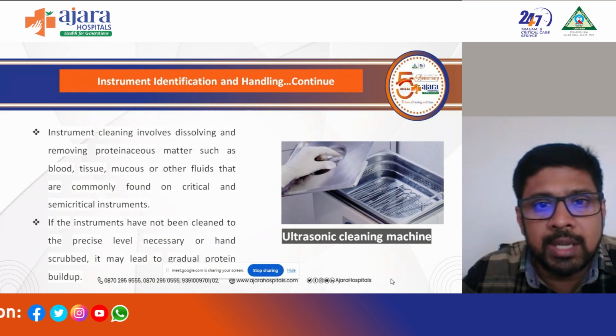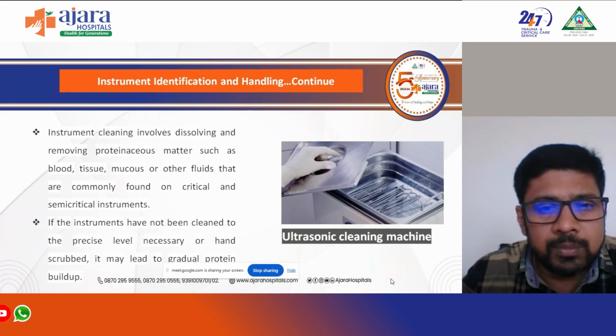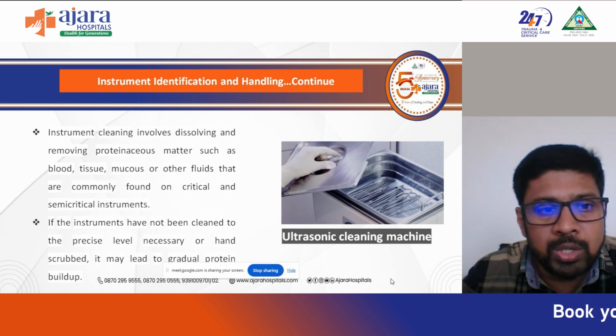Instrument cleaning involves dissolving and removing any biological products like blood, tissues, and mucus. We need to remove them before going for washing.